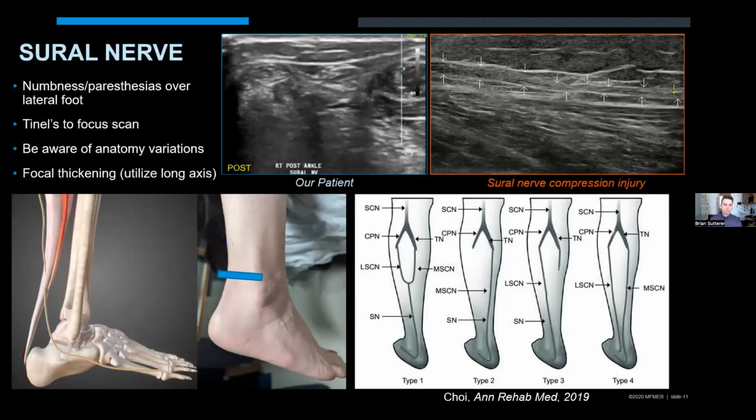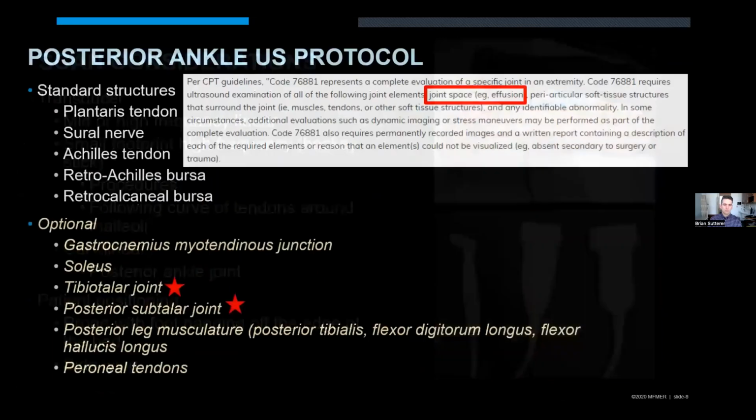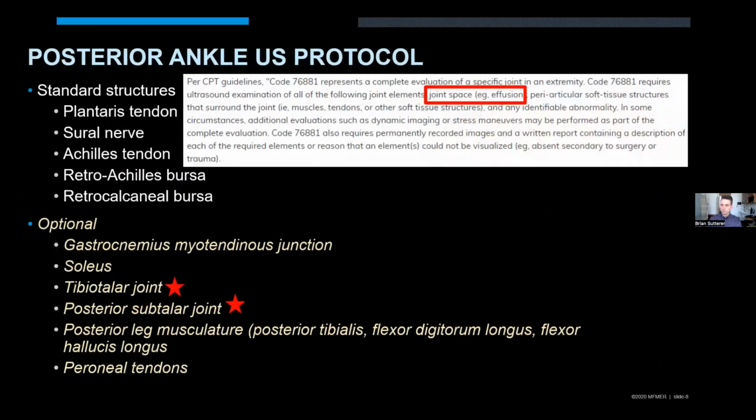I don't know, at least from what I have seen, rarely is it fairly focal pain. It's oftentimes spilling over into the lateral ankle, or it'll spill over into the medial ankle. And so I'll find myself taking a look at the fibular tendons if they have more lateral-based pain, or looking at the posterior tib or any of the other flexor tendons on the medial ankle if they have more medial ankle pain. So I think this is one of those regions that has quite a bit of crossover with other areas and other structures. So your point about that was well taken.